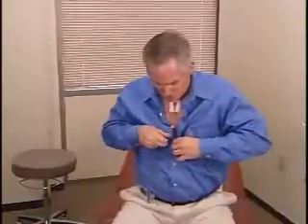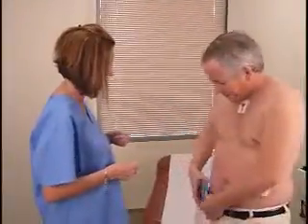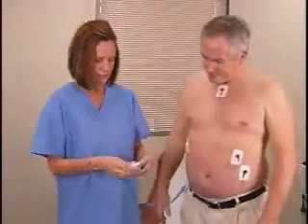When the patient returns after the 24-hour recording period, ask the patient for the patient activity diary. Next, ask them to undress from the waist up and to sit upright or stand for the Holter removal procedure. While the recorder cables are still hooked up to the patient, hold the recorder, turn it over, and carefully remove the battery door.